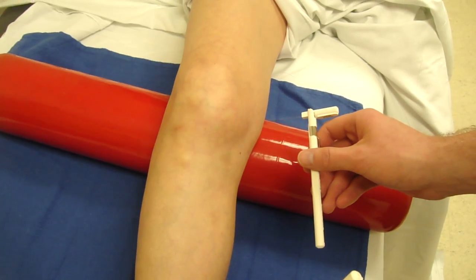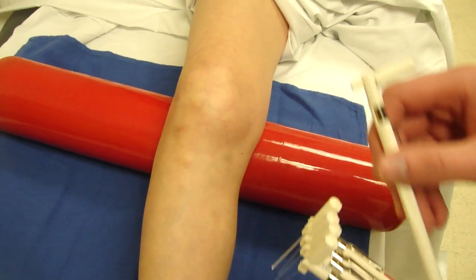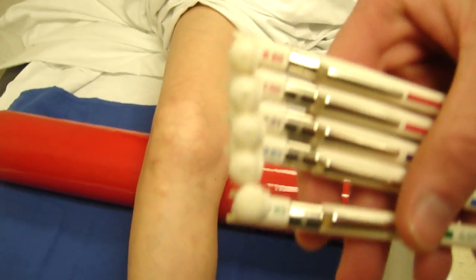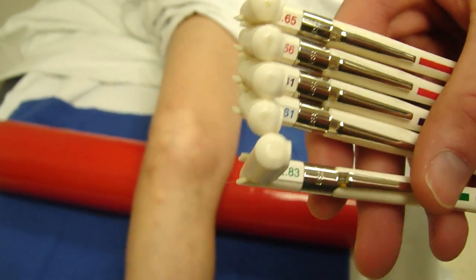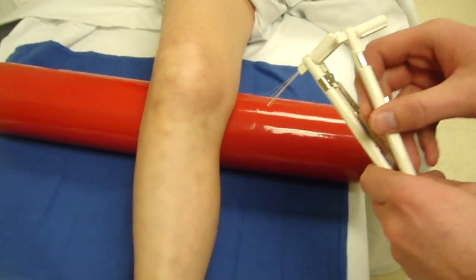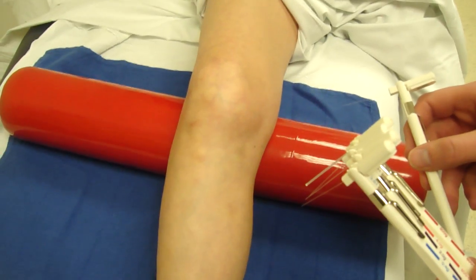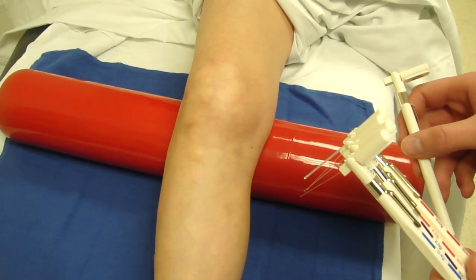The five filaments are of varying thresholds and are applied in an ascending and descending manner for a total of 10 stimuli. With each application, the patient indicates whether the stimulus was perceived or not, and secondly, whether it was painful.